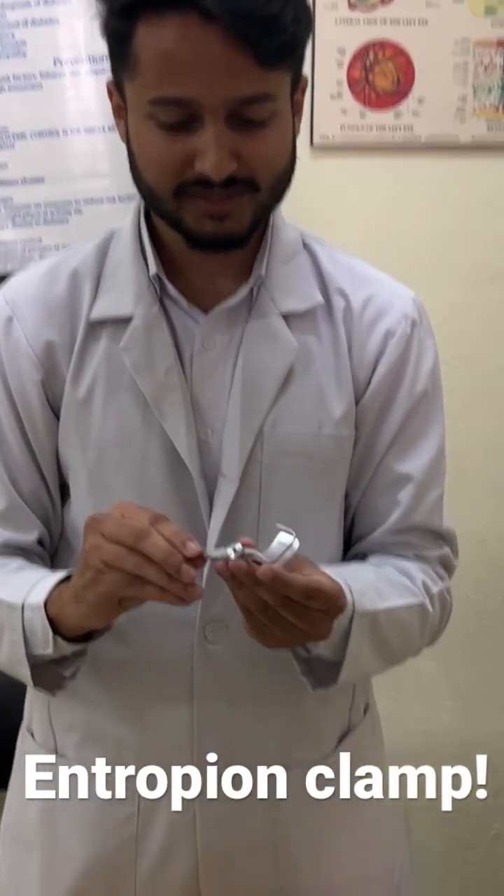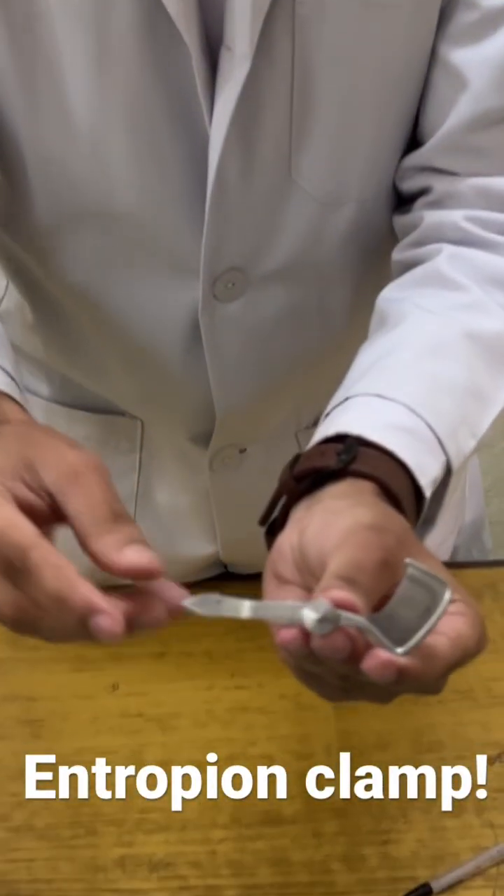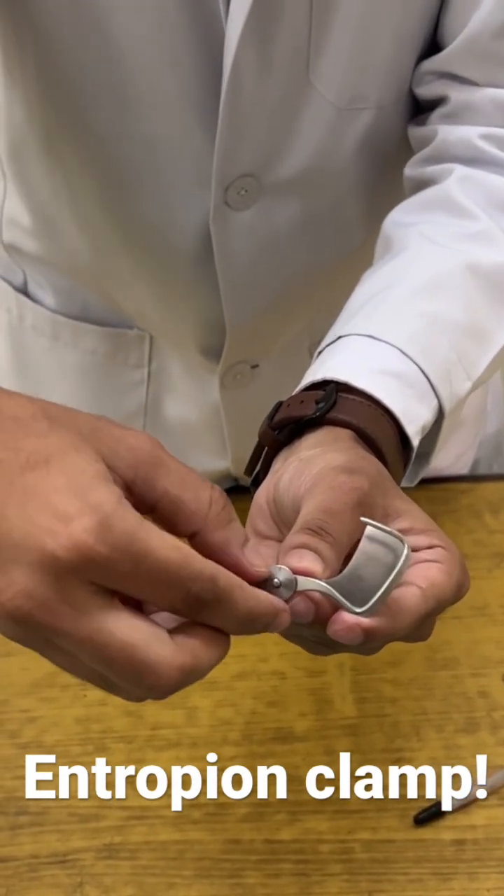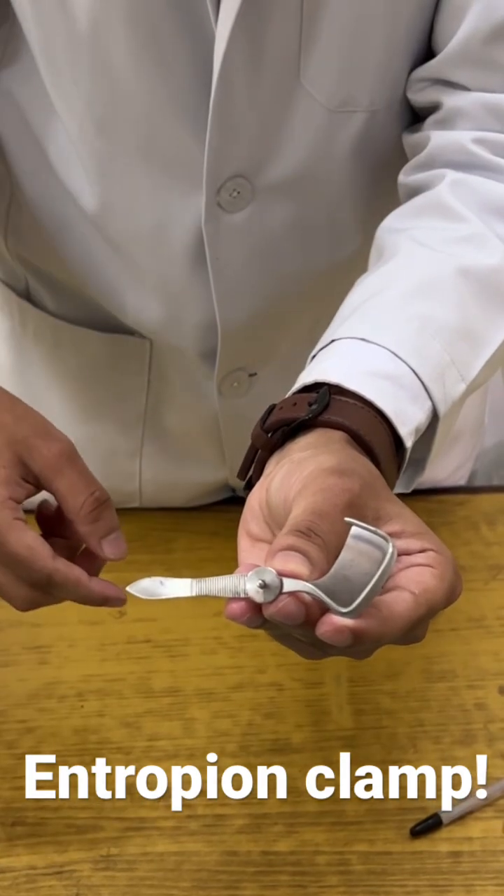This is a lid clamp, also known as an entropion clamp. It is a metallic device with a clamp-like mechanism, which is used to achieve hemostasis during surgery.